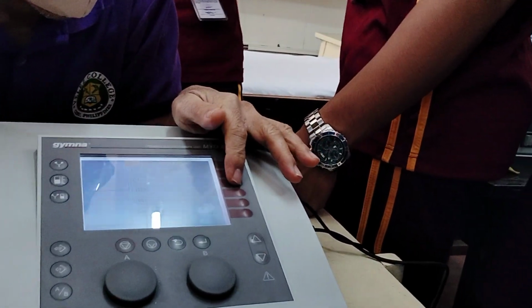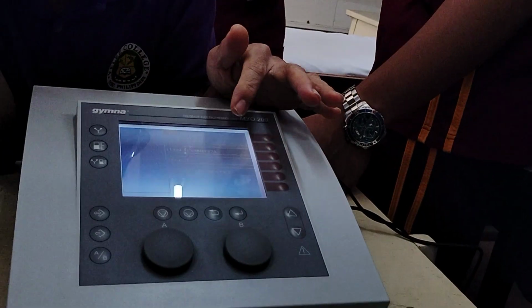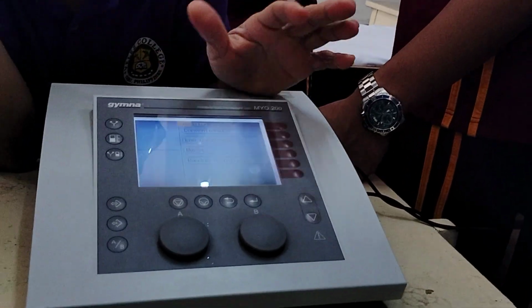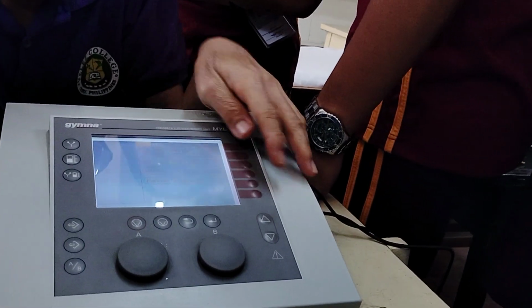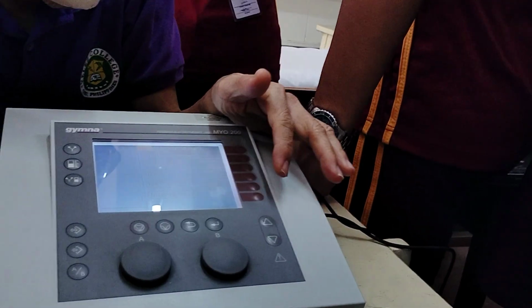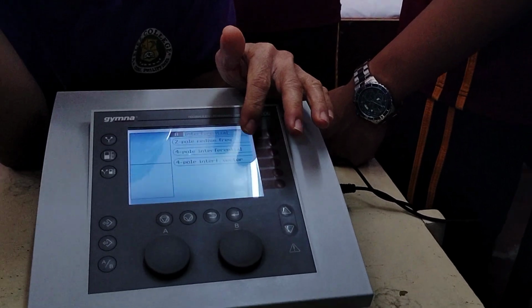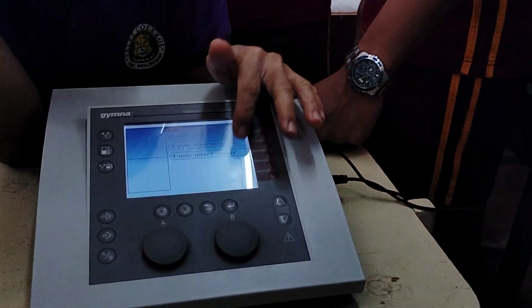When you press TENS, you have conventional, low frequency, burst, and frequency modulation. And if you have interferential, you have 2-pole, 4-pole, with vector scan or without.